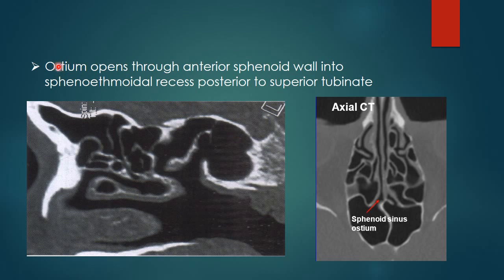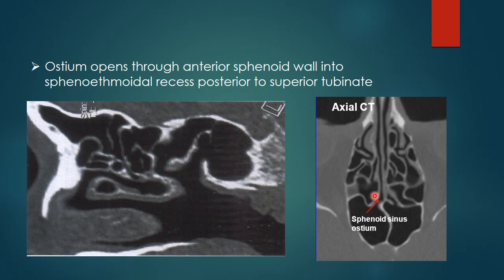The sphenoid sinus drains through the sphenoid sinus ostium, which opens through the anterior sphenoid wall into the sphenoethmoidal recess, which is posterior to the superior turbinate. The sagittal CT image shows the inferior turbinate, middle turbinate, superior turbinate, and sphenoid sinus. The ostium of the sphenoid sinus opens just posterior to the superior turbinate into the sphenoethmoidal recess. In the axial image, both bilateral sphenoid sinuses can be seen opening into the sphenoethmoidal recess.